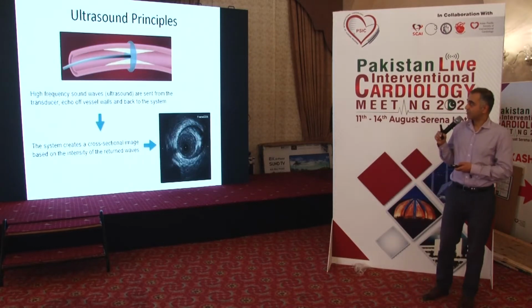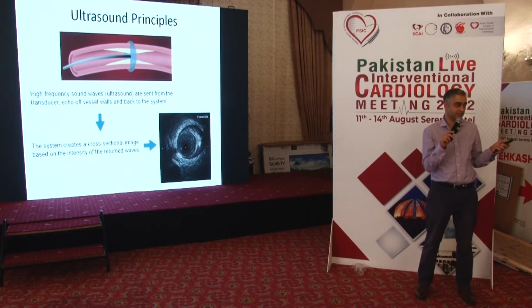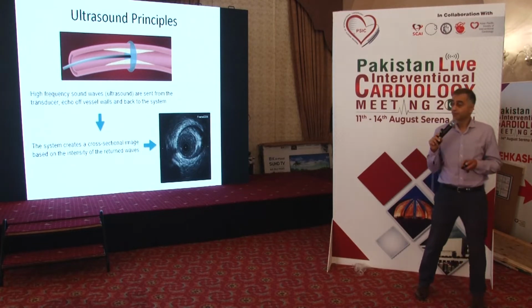Okay, so how does ultrasound work? So the ultrasound probe that you will see in a while basically sends out high frequency sound waves. So remember, your normal hearing is between 20 and 20,000 hertz, and anything more than 20,000 hertz is ultrasound. Okay, so you and I can't hear ultrasound. Our ears are not tuned to hear ultrasound frequencies, but certain animals can.